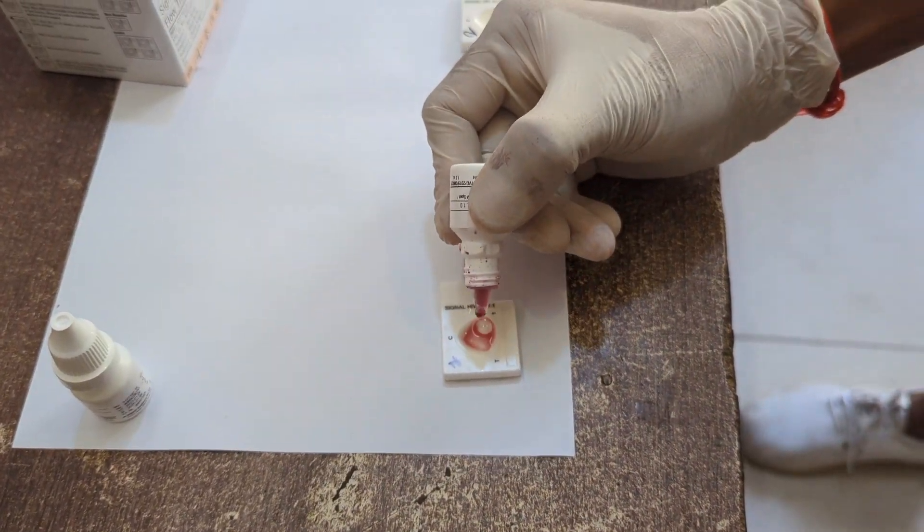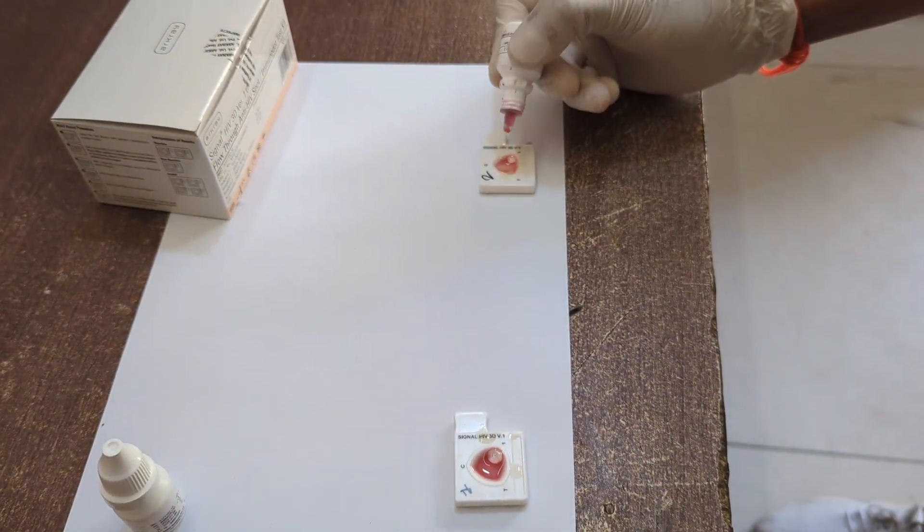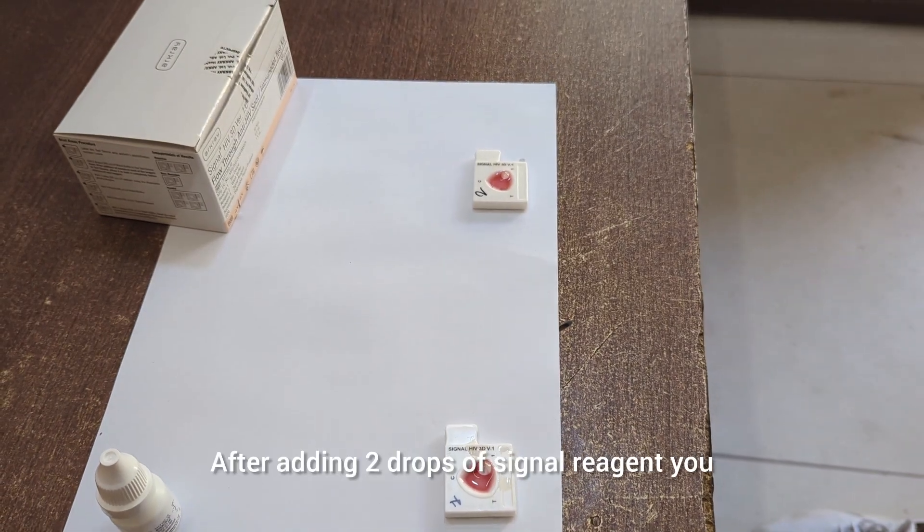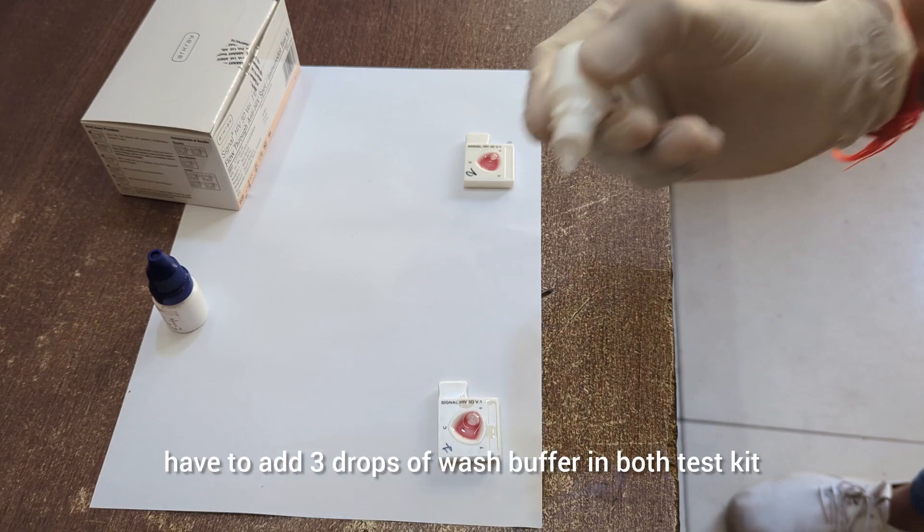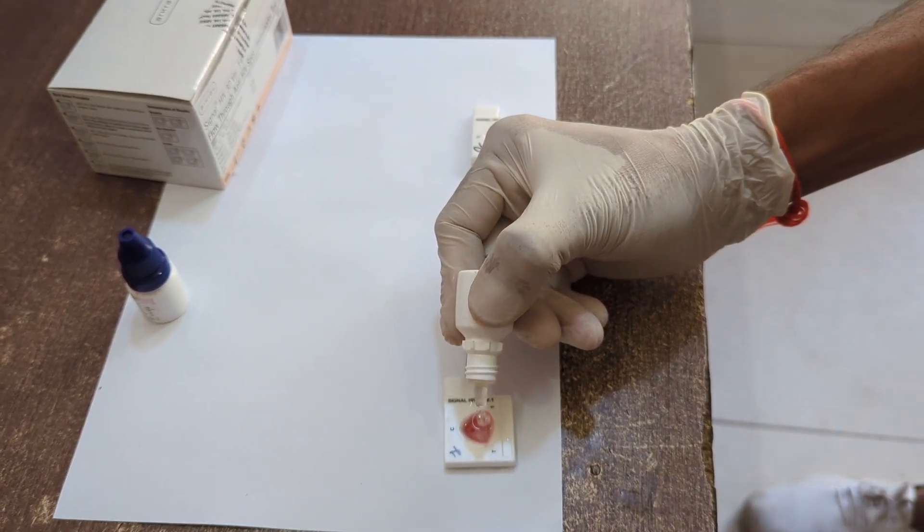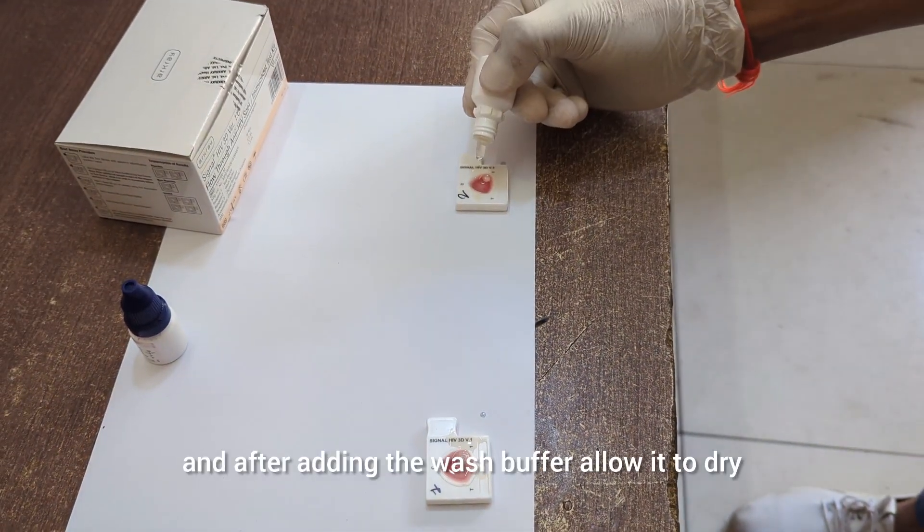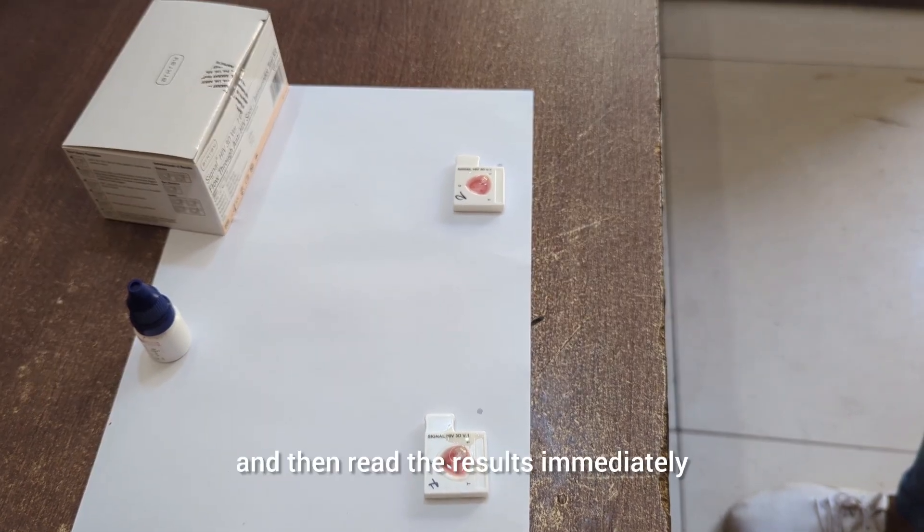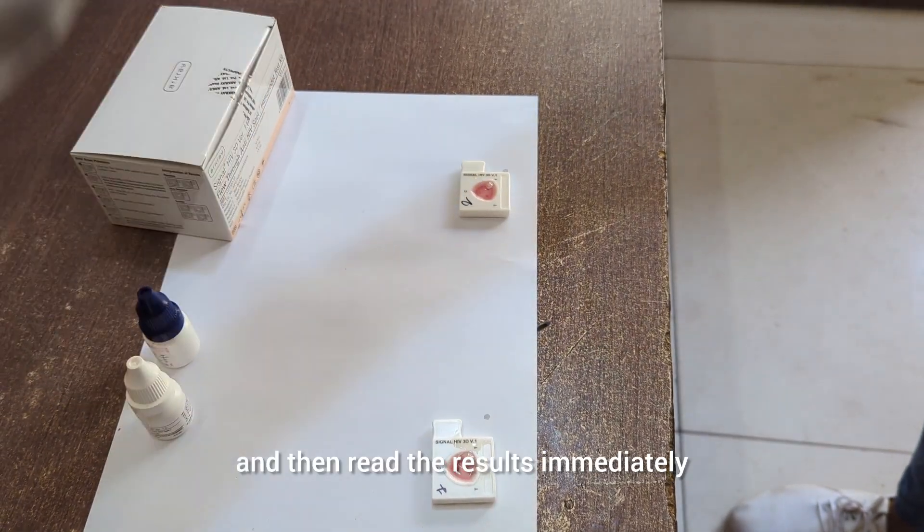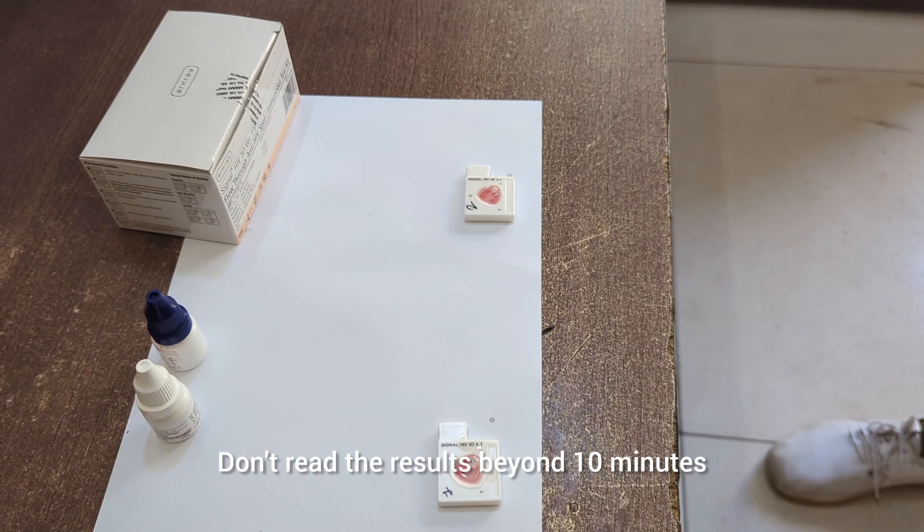After adding the wash buffer, you have to add two drops of signal reagent in both test kits, test kit number one and test kit number two. After adding two drops of signal reagent, you have to add three drops of wash buffer in both test kits.